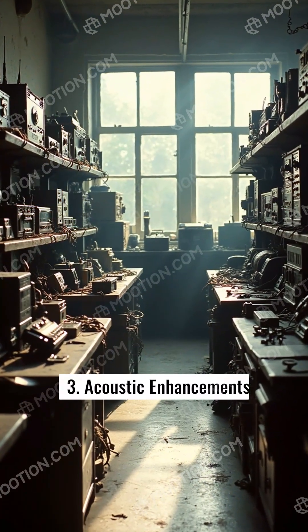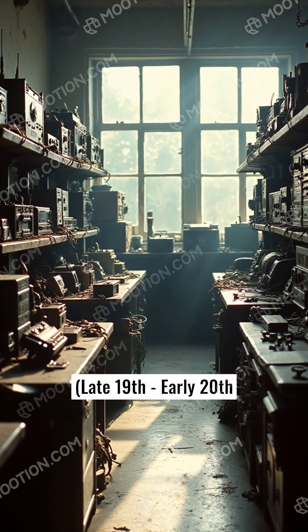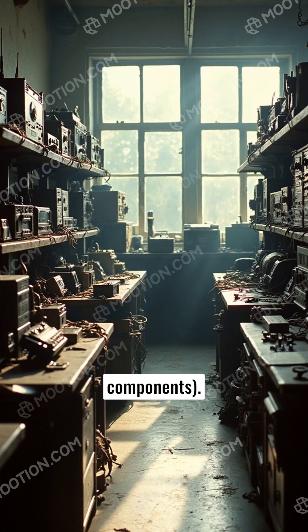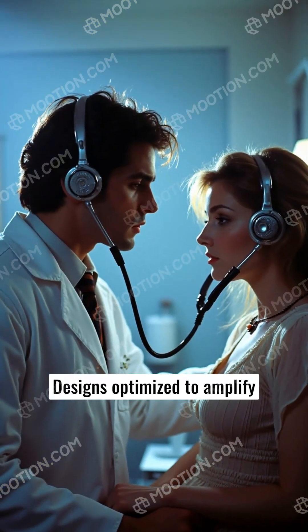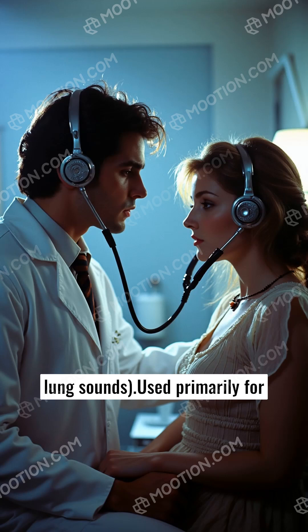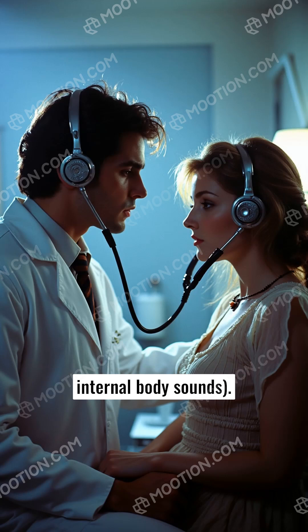Acoustic enhancements, late 19th to early 20th century. Materials improved: rubber tubing and better metal components. Designs were optimized to amplify specific frequencies — heart versus lung sounds. Used primarily for auscultation, meaning listening to internal body sounds.